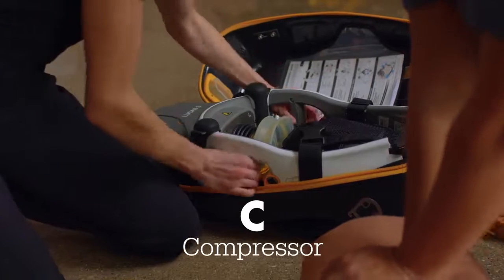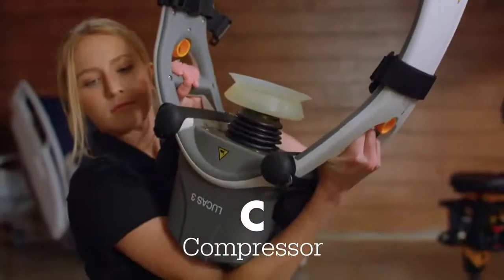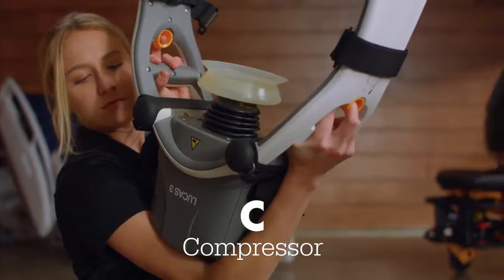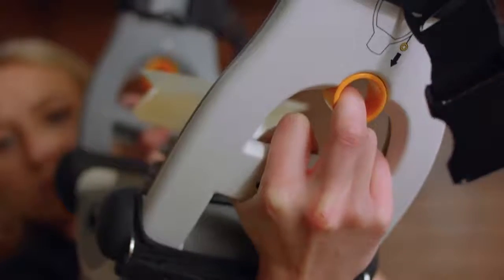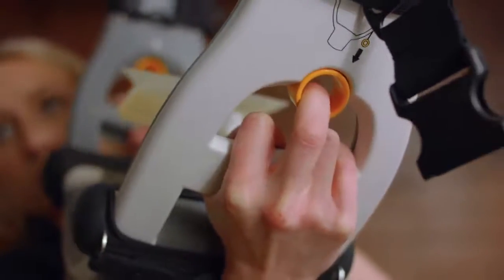C stands for compressor. Lift the upper part from the case with the control panel facing toward you. Cradling the device like this allows for optimal placement control. Quickly pull and release the yellow rings to ensure the claws on both sides are open and ready to meet the backplate.